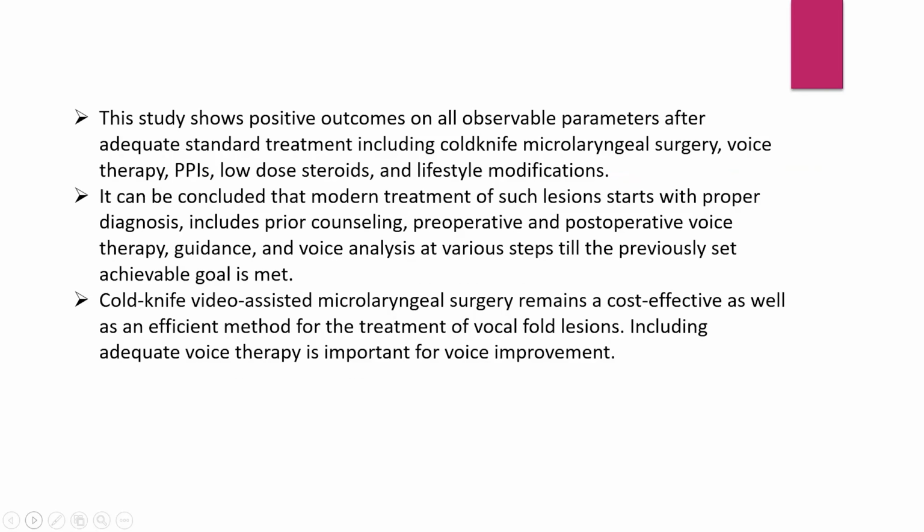The study shows positive outcomes on all the observable parameters after adequate standard treatment. It can be concluded that the modern treatment of these lesions starts with proper diagnosis, and includes prior counseling, pre-operative and post-operative voice therapy, guidance, and voice analysis at various steps till the previously set achievable goal is met. Cold knife video-assisted microlaryngeal surgery remains a cost-effective as well as an efficient method for the treatment of the lesions. Including adequate voice therapy is important for the improvement of voice. Next slide, please.